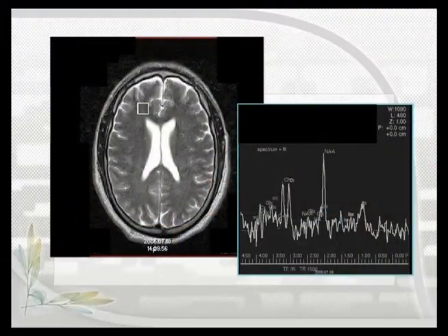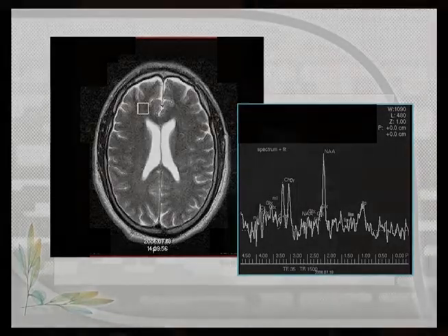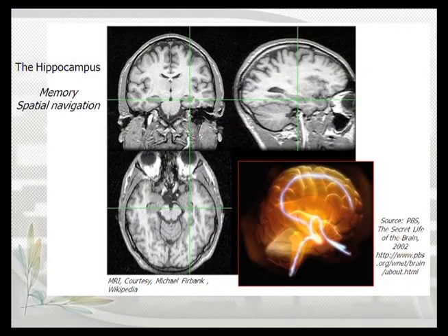This is what an MR spectroscopy curve looks like. Here's the N-acetyl aspartate peak. Here is some of the glutamine and glutamate spikes stuck in here. It's great fun to be able to look to see chemical signatures of inflammatory disorders. It's black and white. Hippocampus, you know, is a memory area at the base of the brain.